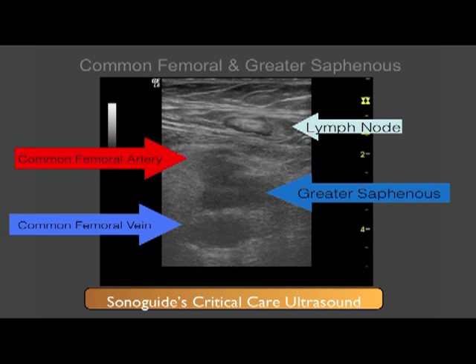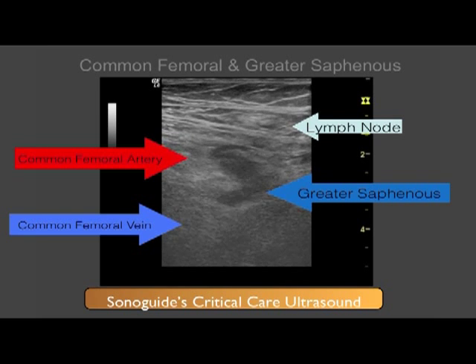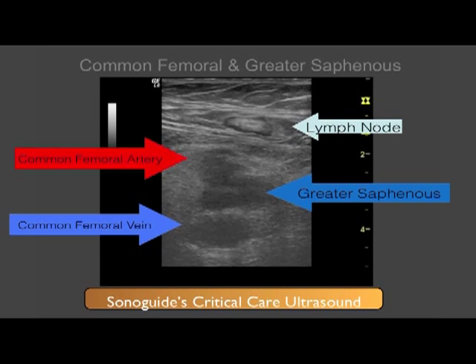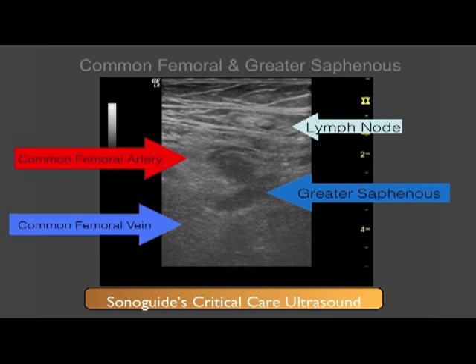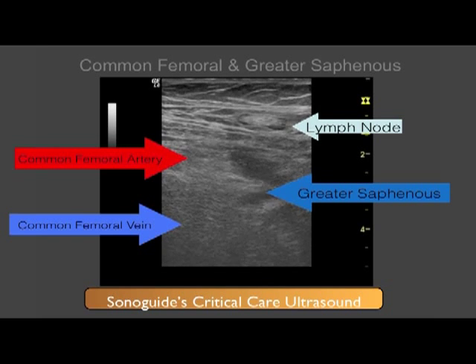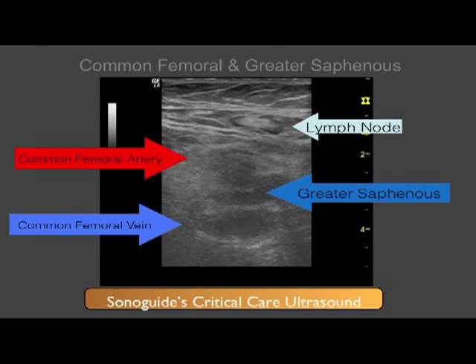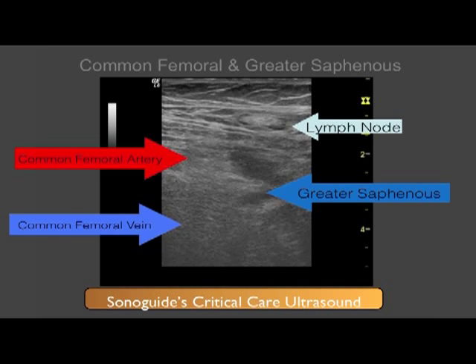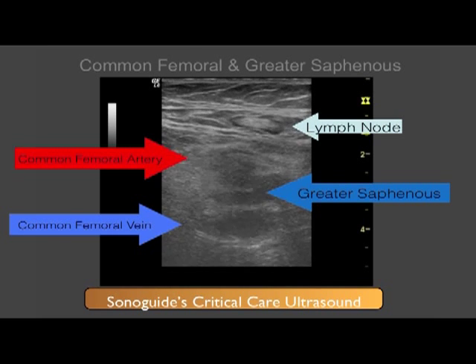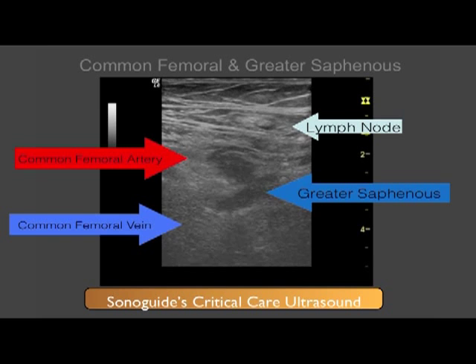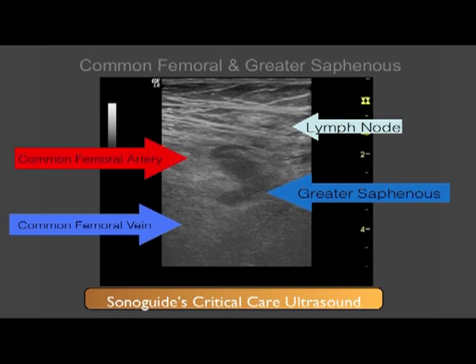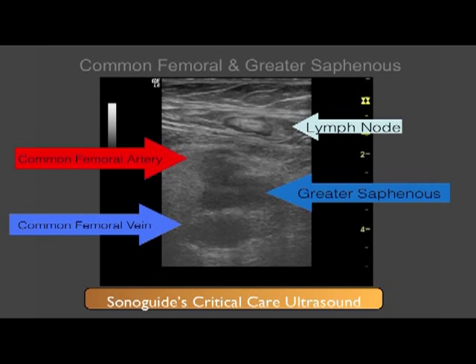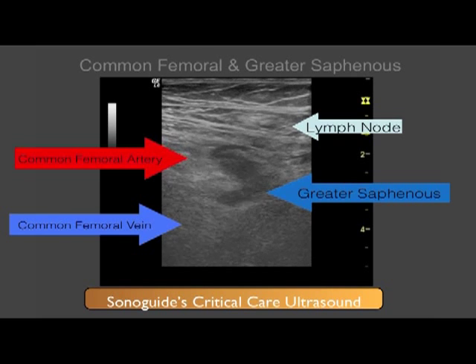Going back to our original patient, I am now demonstrating how to use compression in real-time scanning using the B or brightness mode. This is similar to the approach you would take to perform central venous access under ultrasound guidance in real-time. You will note that the common femoral artery has a thicker wall and does not compress as easily as the common femoral or greater saphenous veins.